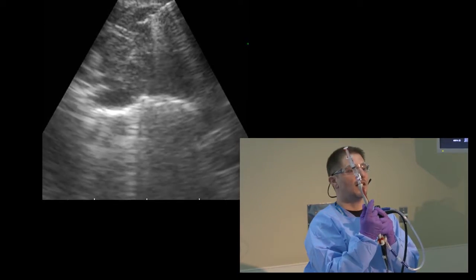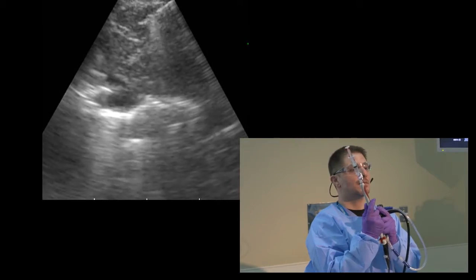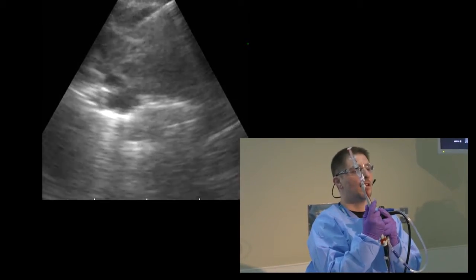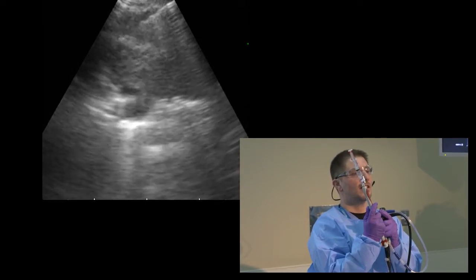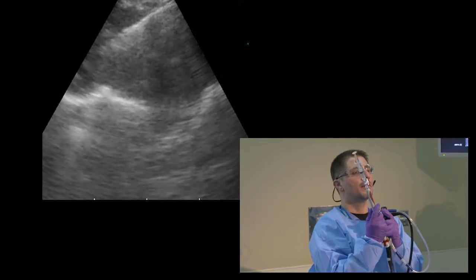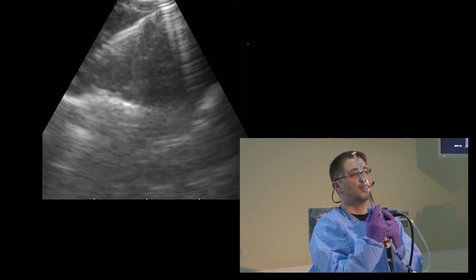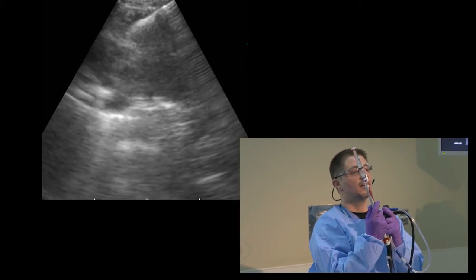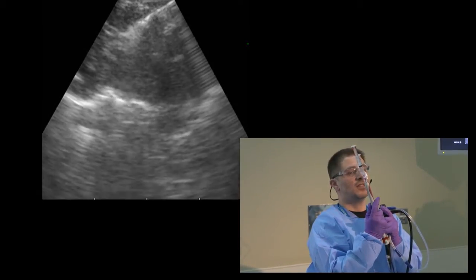And then change your angle and sample different areas. Changing the angle can be, as I mentioned before, with changing your thumb flexing on these lymph nodes. But when you change your thumb, you should be at the proximal edge of the lymph node, not at the far end. That will give you a chance to change it.